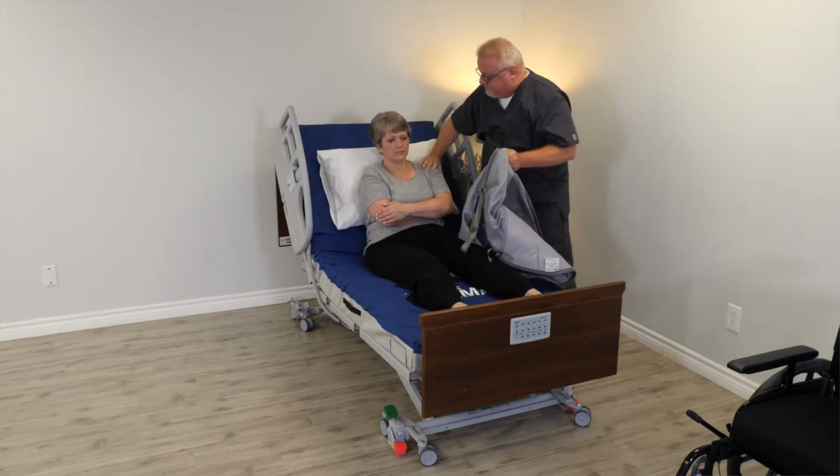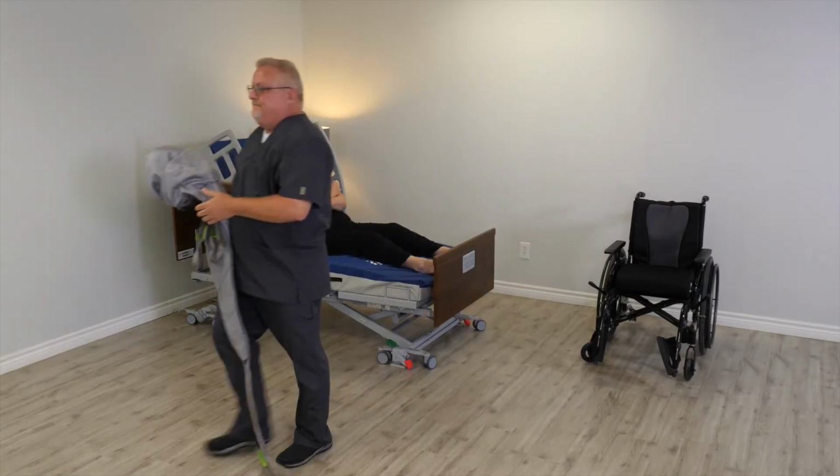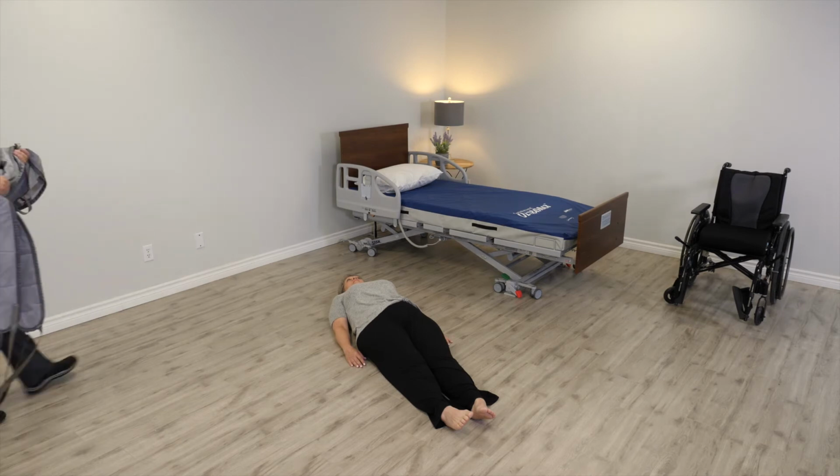Follow these same steps for transfer from chair to commode. The F500P can also be used to lift a patient safely from the floor.